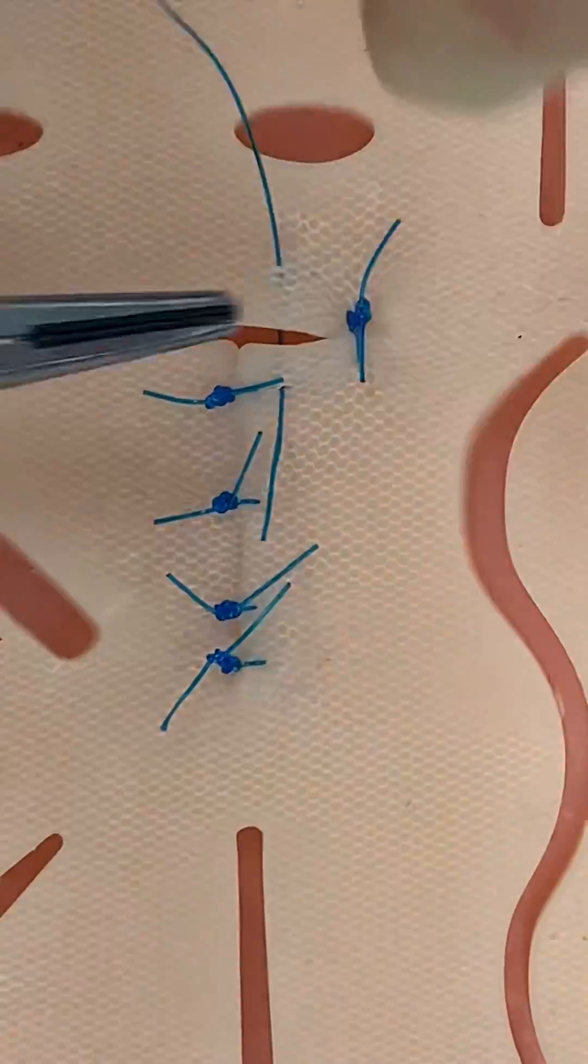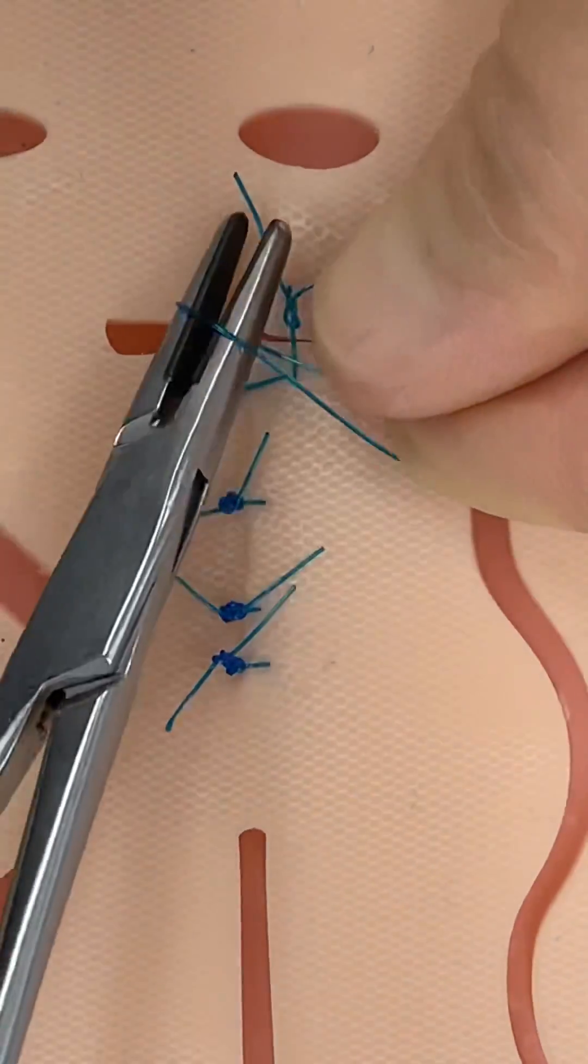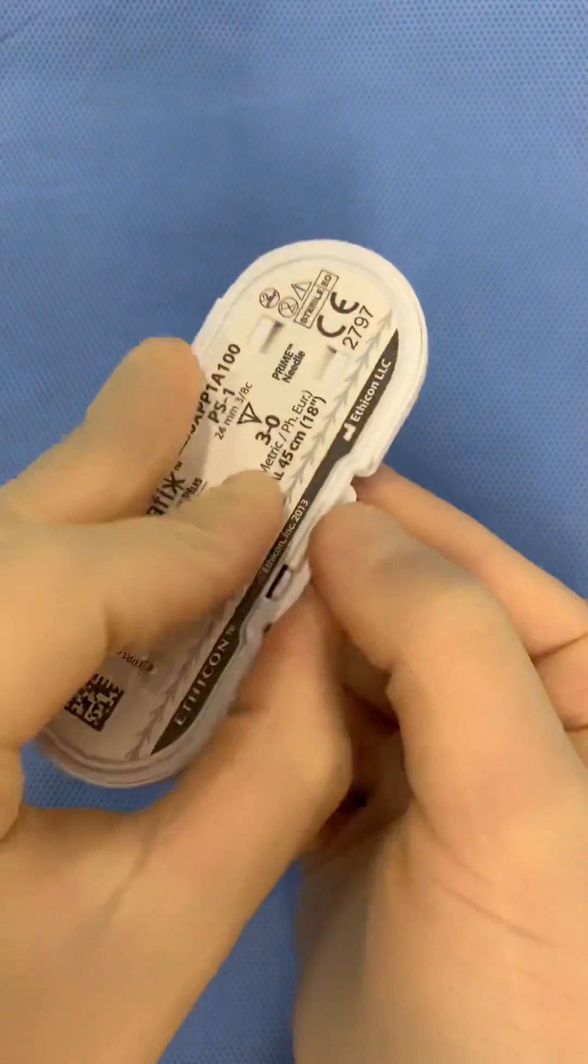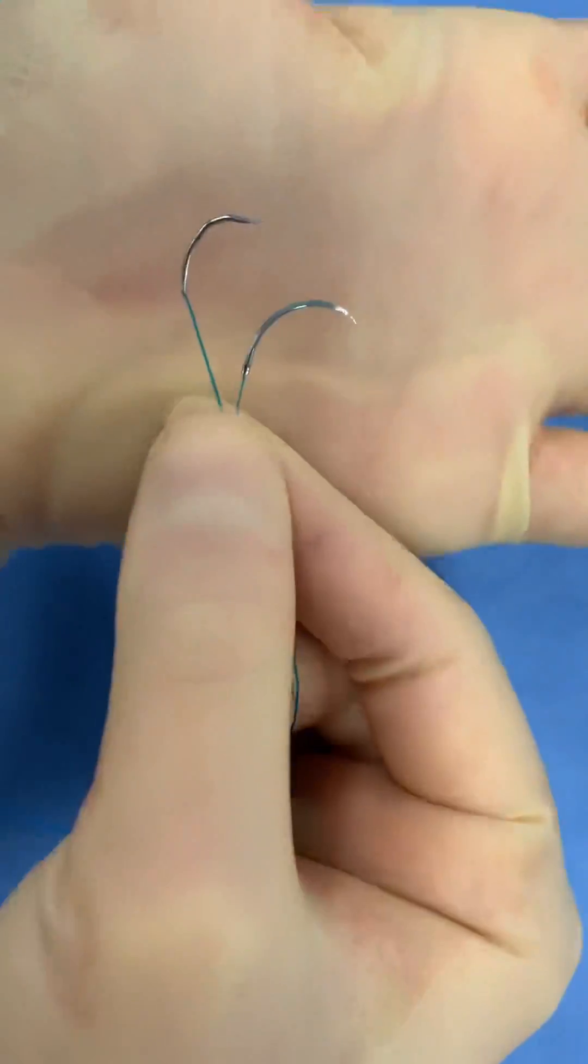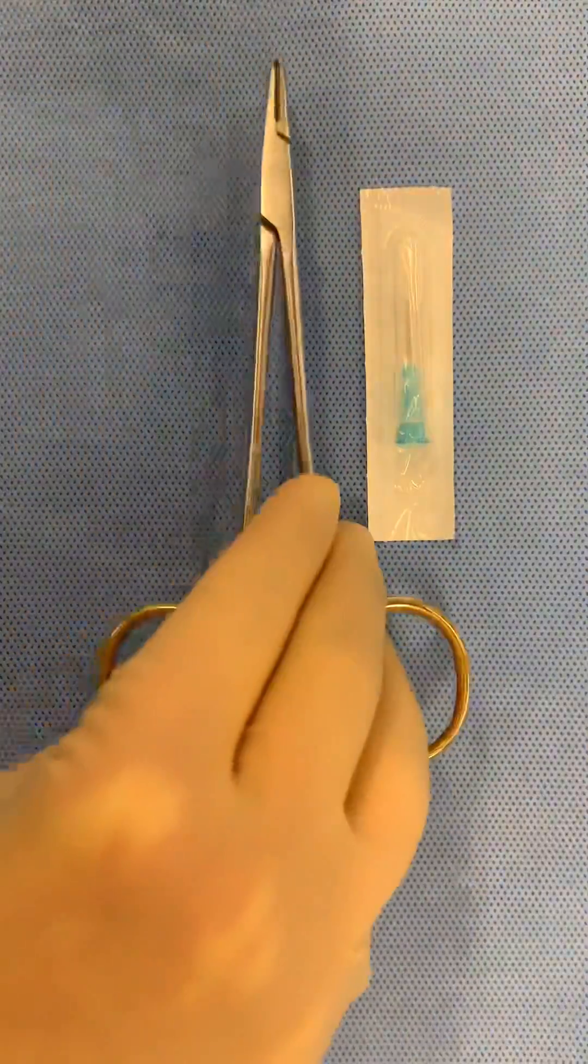Knowing how to give stitches can be a useful skill in an emergency, but you should also know how to improvise if you don't have access to fancy suture material. So here's how you can make a DIY swaged suture needle in under 2 minutes.